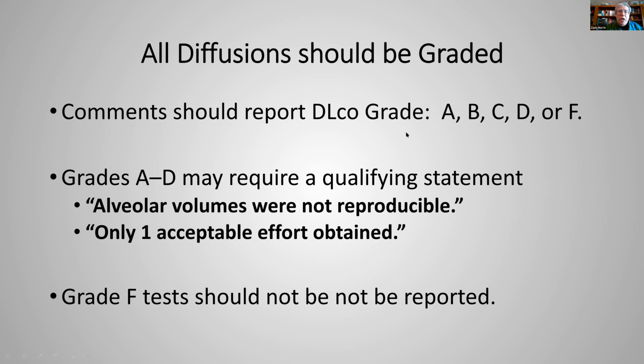When we stopped promoting it with the techs, in other words, the staff were grading and whatnot, we kind of left the techs on their own at that point without frequent instruction, meetings, or little sessions on how to grade. We found that the effect wore off after about a year and a half. It started to deteriorate within the year, and by 18 months later, we were back where we started. That's why it's important, I think, to grade these for the technicians. It's their own self-report card. They start doing better when they see whether they're actually doing grade A, B, C, or D.